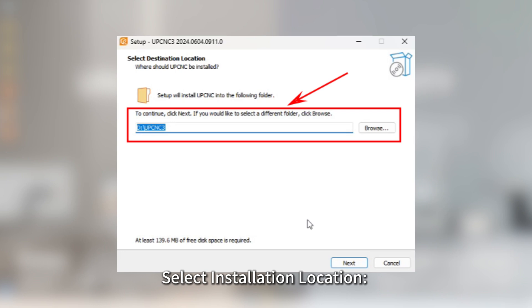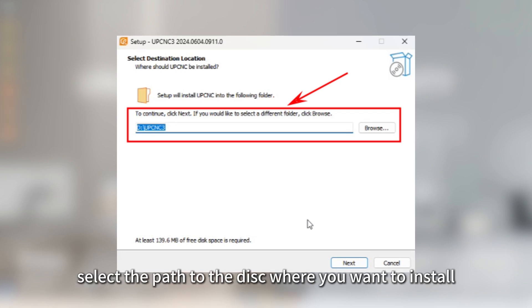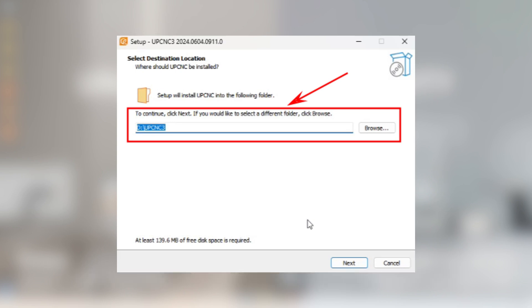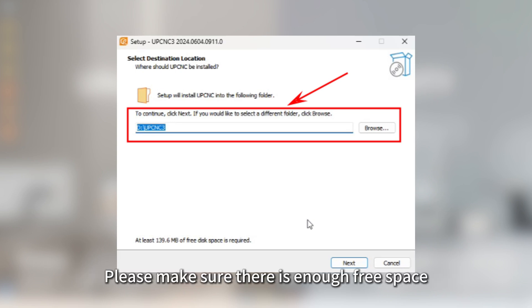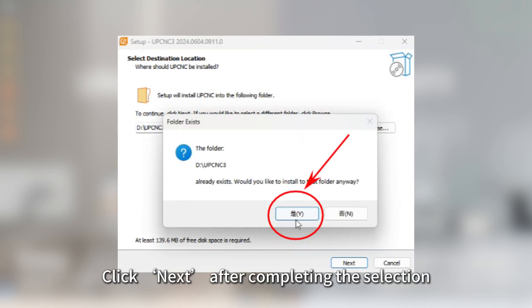Select Installation Location. On the Installation Location pop-up page, select the path to the disk where you want to install. Please make sure there is enough free space on the disk to avoid the problem of insufficient capacity during the installation. Click Next after completing the selection.